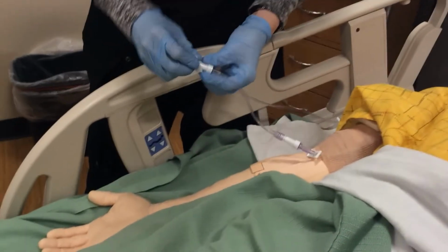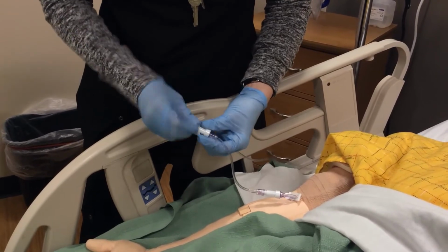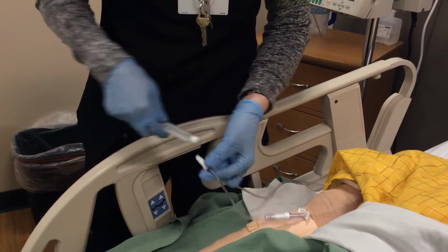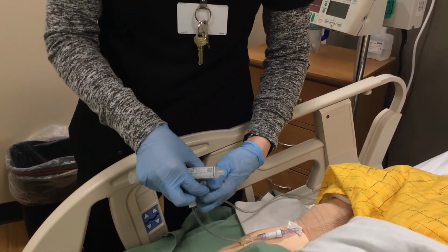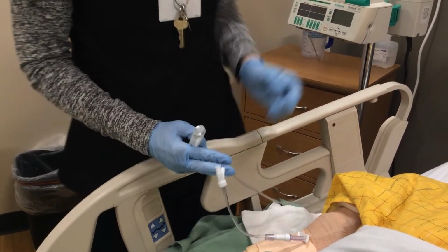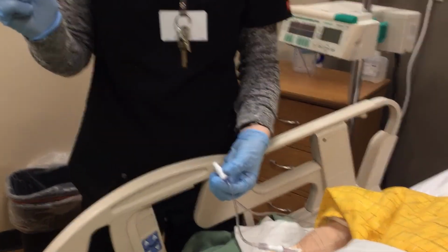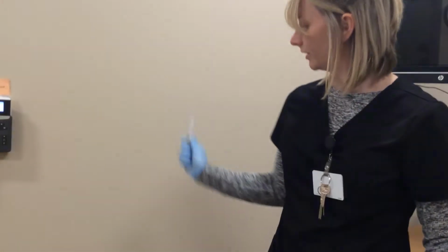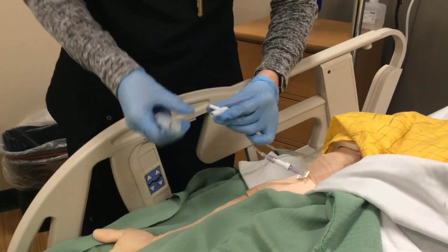Looking at my site again, just because I just gave medications and stuff like that. I'm going to clean off again the port that is closest to my patient. All right. All right, let me get rid of that little bit of air bubble in there. There we go. All right, so again, I'm going to push here, right above that port.